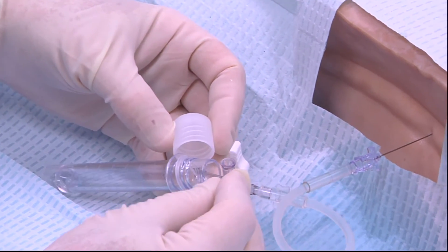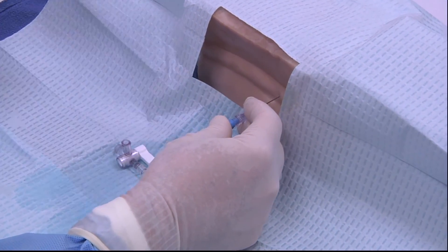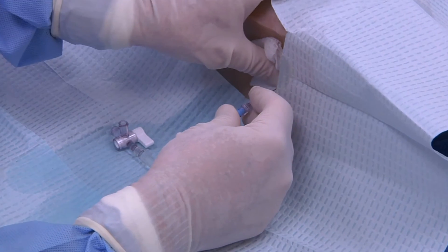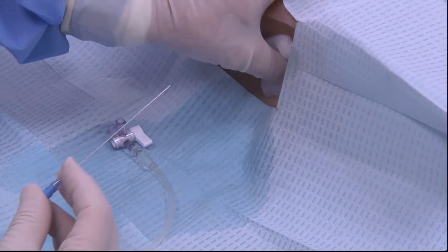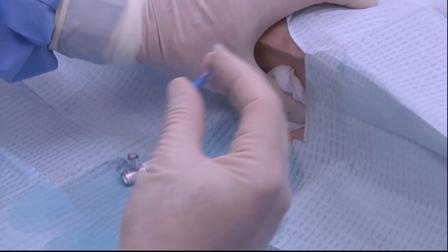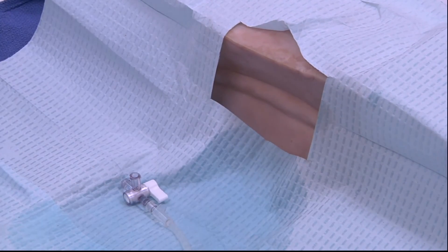Once we've filled all four test tubes, it's time to remove the needle. The stylet is replaced back in the lumbar puncture needle, and then the needle is withdrawn. The lumbar puncture needle is never moved forwards or backwards without the stylet in place. Once you've removed the needle and the lumbar puncture procedure is over, you'll rub the spot where the needle is removed and apply a Band-Aid.